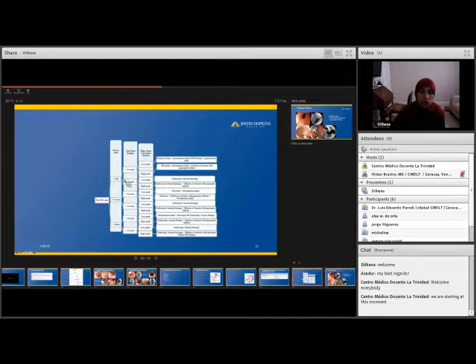So this is an algorithm that we published, and this takes into consideration the size of the leak, the time from surgery, high versus low-grade stenosis, and based on this, we present a sort of algorithmic approach to managing these patients. So if the patient presents early, that is less than 6 weeks, often it is easy to manage these patients. And if the size of the leak is small, so less than 5 millimeters.